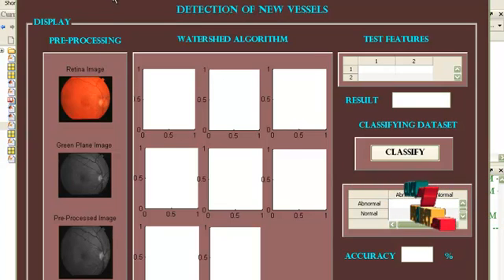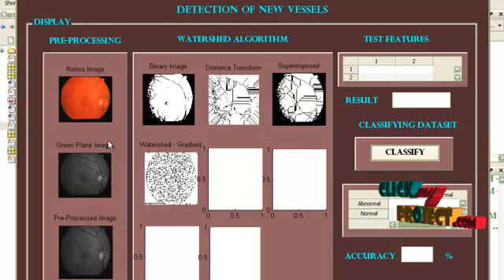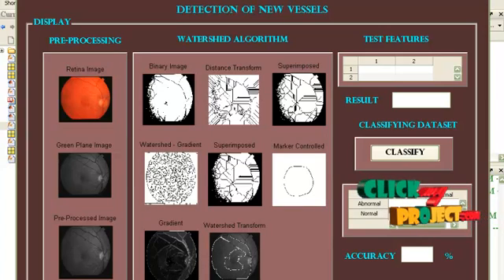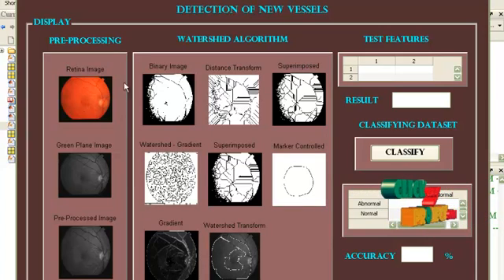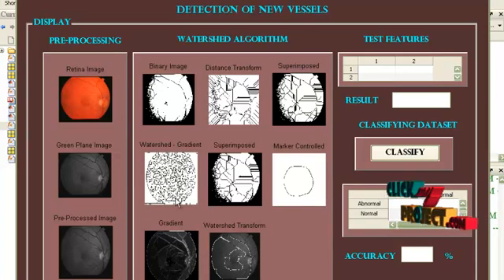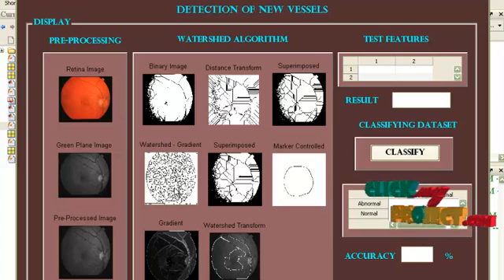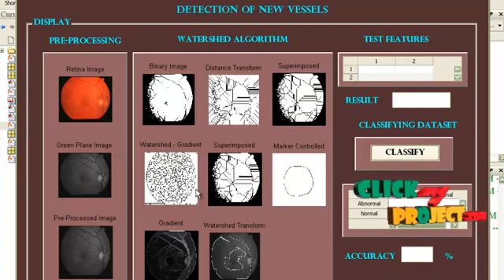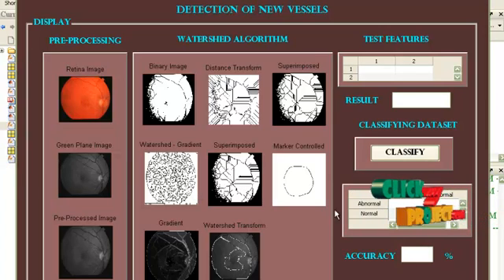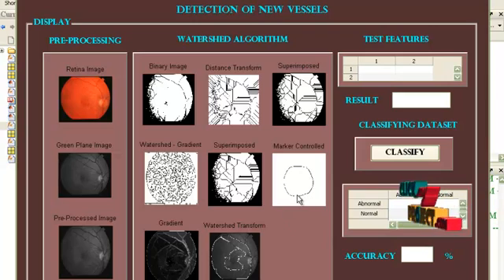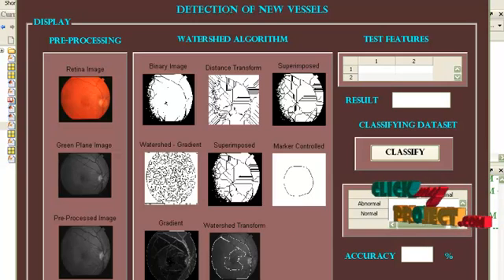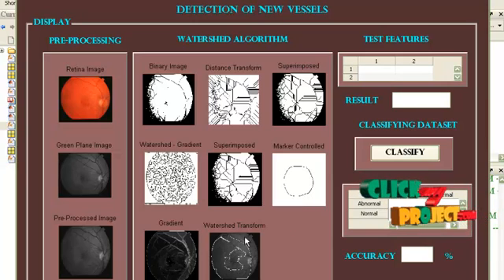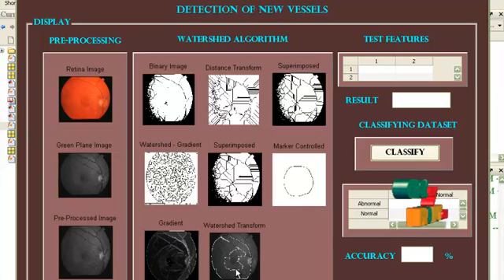And apply watershed algorithm. This is a binary image. This is a distance transform and this superimposed image. Apply a watershed gradient on it and apply the superimposed image to it. Now you have to create a marker control and this is the gradient extracted.